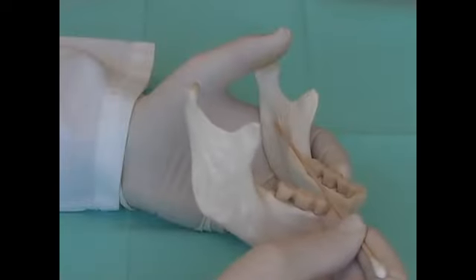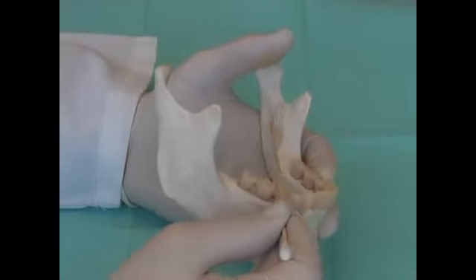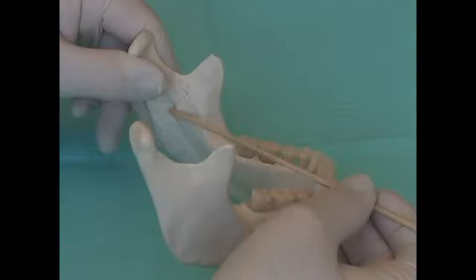The target site for this injection is the inferior alveolar nerve just before it enters the mandible. The mandibular foramen is located midway between the anterior and posterior borders of the mandible. The height of the foramen is approximately 1 centimeter above the mandibular occlusal plane.